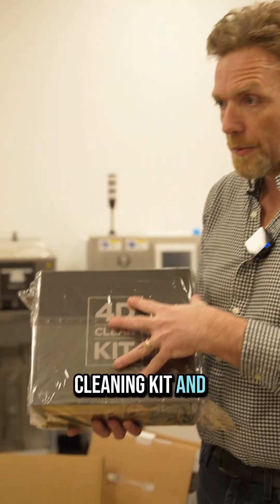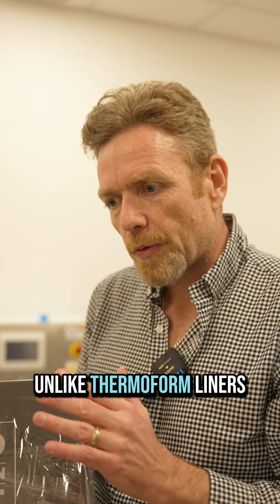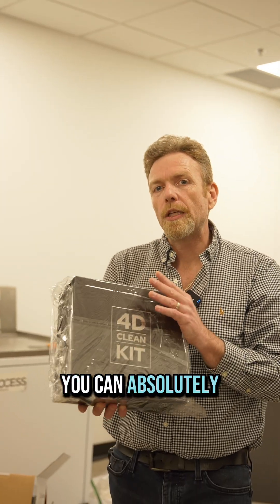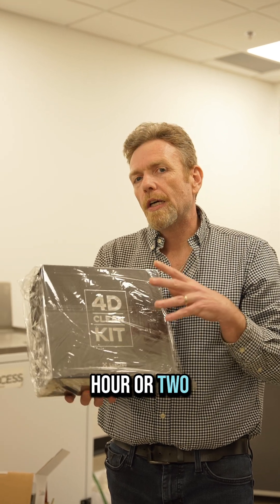So with this cleaning kit and with a Polyden tablet, you're about 10 minutes a day to keep your aligner perfectly clean. Unlike thermoformed aligners, if a 3D printed aligner becomes discolored, you can absolutely get it back to perfectly clear — maybe about an hour or two in this device.